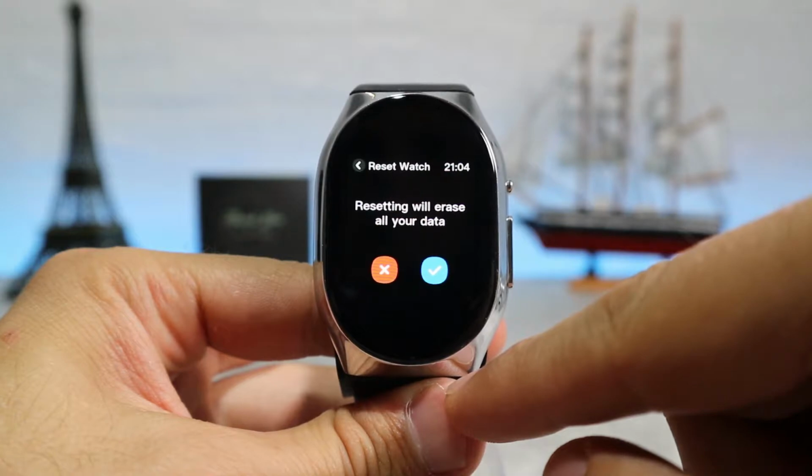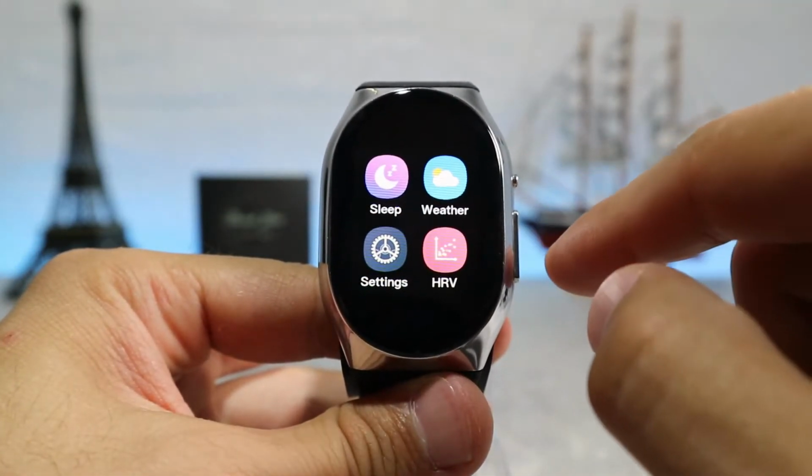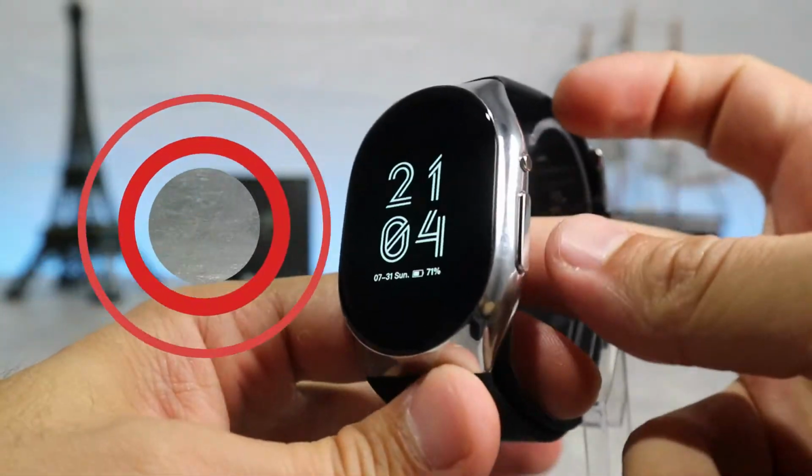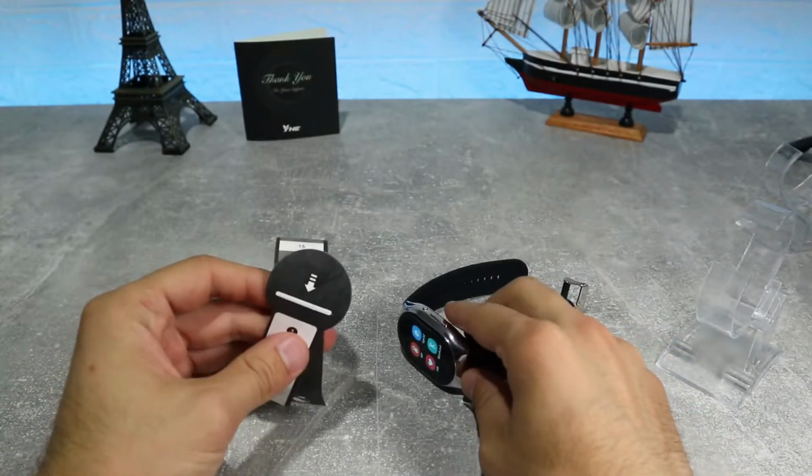In the factory reset, we can reset if we want to get back to default or if we want to connect with another phone. Now we're going to put on the watch and test some of the measurement options for ourselves.